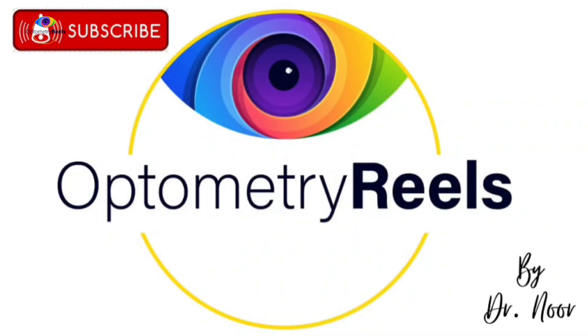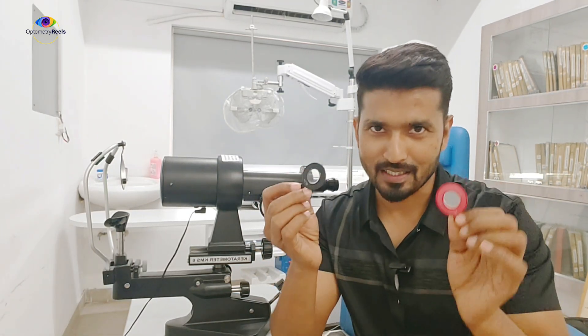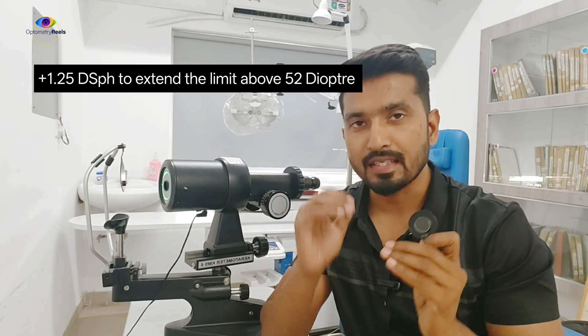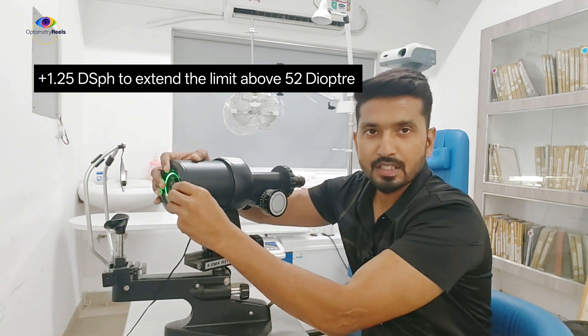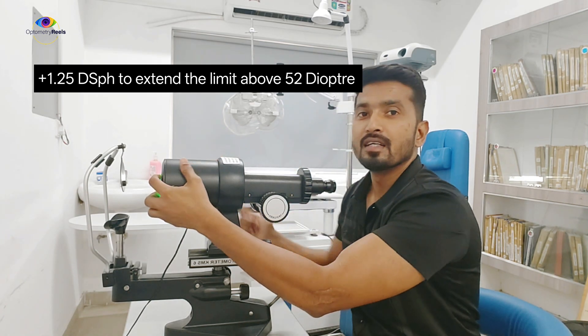Today we are diving into a new concept — extended keratometry. To perform extended keratometry, you need to remember these two magical lenses: one is a +1.25 diopter lens and the other is a -1 diopter lens. Using these two lenses, we do the extended keratometry. We use the +1.25 diopter lens to extend the reading of the keratometer when the cornea is steep and your value is more than 52 diopters. You place this lens in front of the keratometer objective lens.